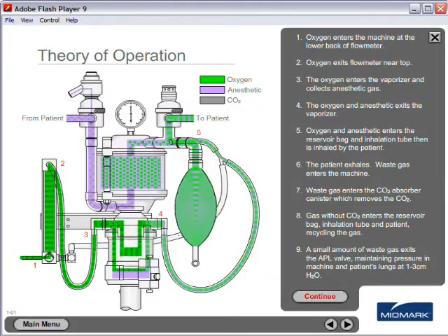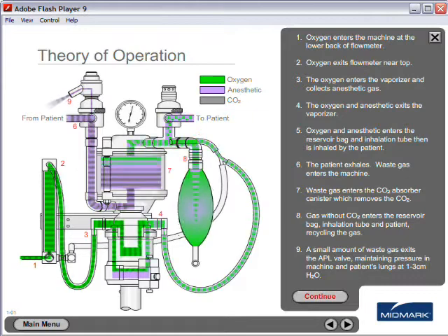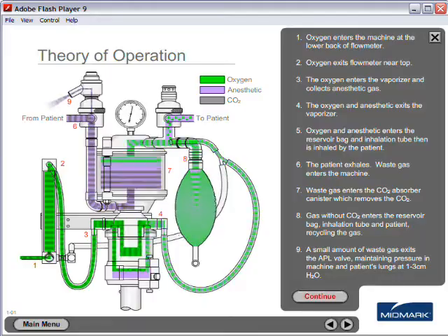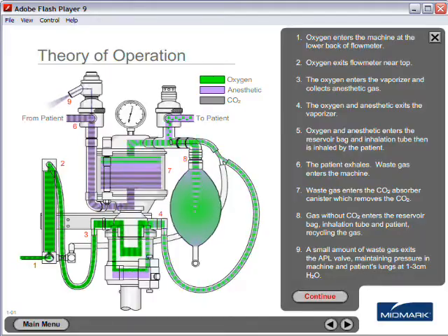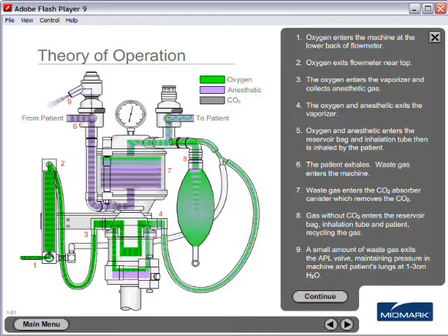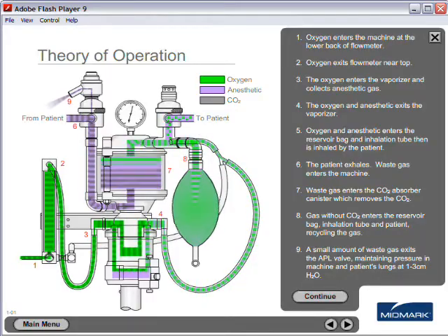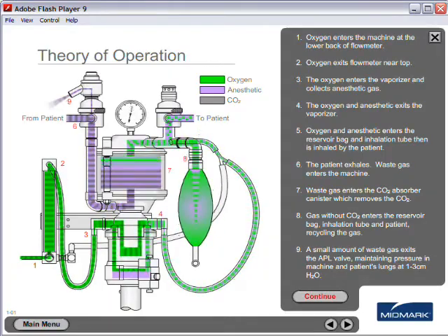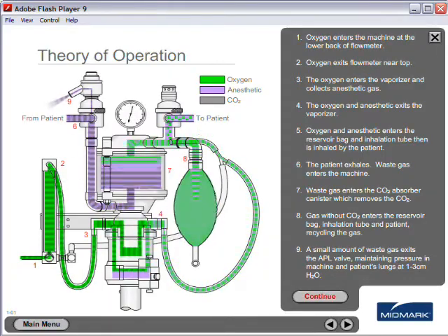Oxygen and anesthetic enters the reservoir bag and inhalation tube, then is inhaled by the patient. The patient exhales and waste gas enters the machine.